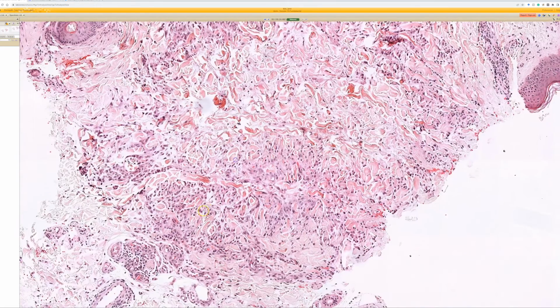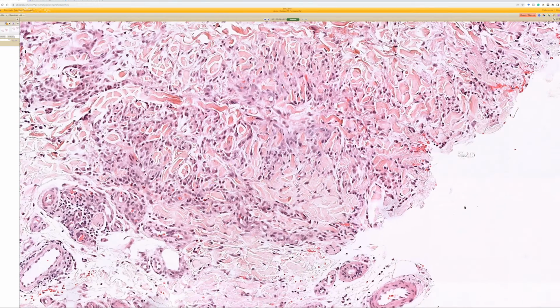All right. The other thing that can do this pattern is another granulomatous disease that we're not going to go into here. There's a group of granulomatous diseases called reactive granulomatous dermatitis, and they encompass a spectrum of diseases, including interstitial granulomatous dermatitis, which tends to have a lot of collagen trapping, and some of the collagen bundles float and are wrapped tightly by histiocytes with a little space, but they're nice palisading.